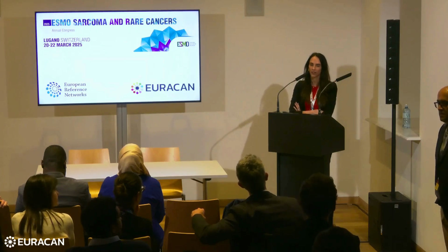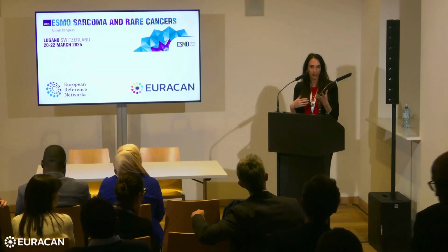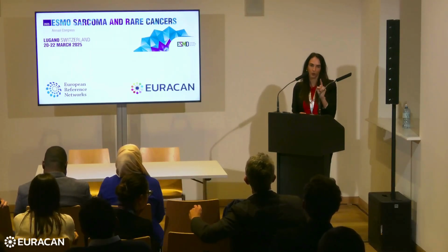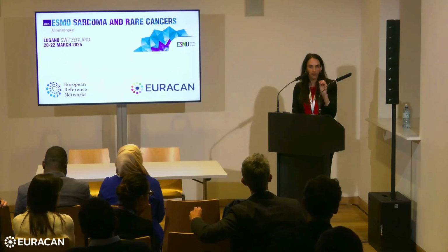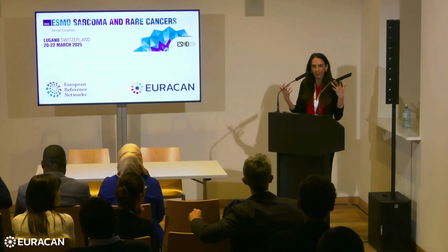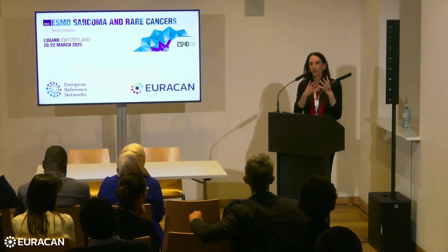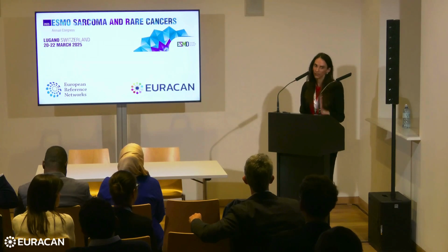There is a mixture, and it could also be due to the inflammatory scene of this kind of lesion, but MR spectroscopy in these lesions may be very tricky and misleading for tumor, because when I see such a high choline peak, I immediately think of tumor because of the high cell turnover. But I think it's a mixture of cell membrane loss and inflammation processes, but this is tricky.